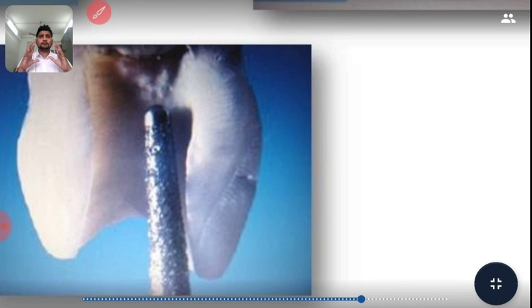Your pulp chambers, your canals will always be in the corner of the room, in the corner of your pulp chamber. So take guidance from the roof, take a long shank spoon, endodontic spoon excavator, feel where you have overhangs, use the round carbide or use this one to just remove those overhangs.